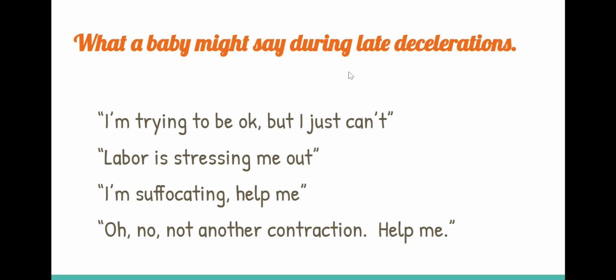What a baby might say during a late decel: I'm trying to be okay, mom, but I just can't do it. Labor's stressing me out. I'm suffocating. Help me. Oh no, not another contraction.